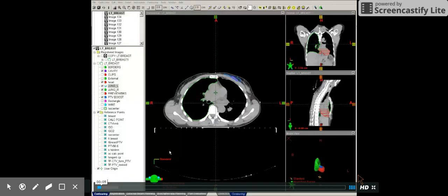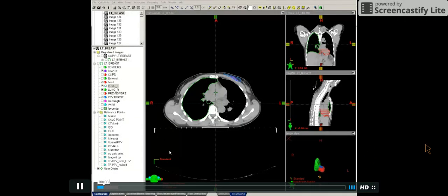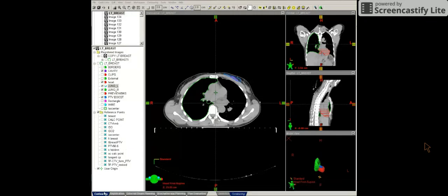In this video, I will show you the contours needed for a 3D breast plan. First, make sure you're in the right workspace, so I'm in the contouring workspace.